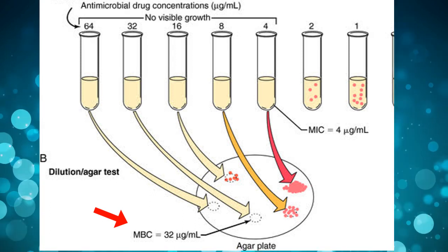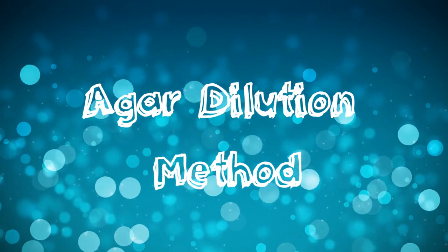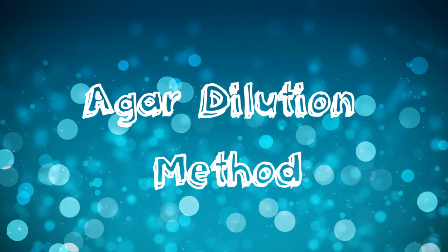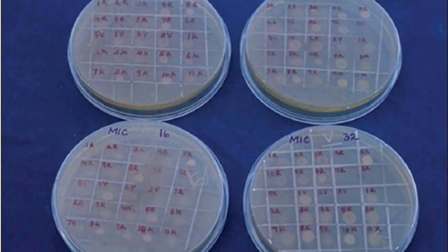Now coming to agar dilution method. In this, we make dilutions of antimicrobial agents in molten Mueller-Hinton agar media and then pour it into the plates. Then allow the molten media to solidify. One plate of media has one particular concentration of antibiotic, which can be tested for sensitivity against multiple organisms.